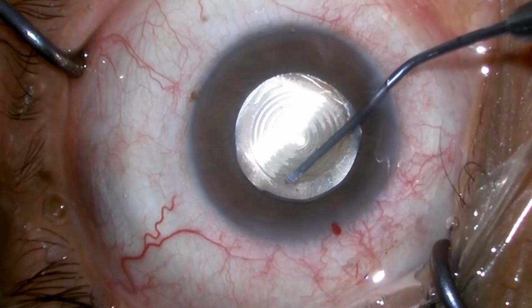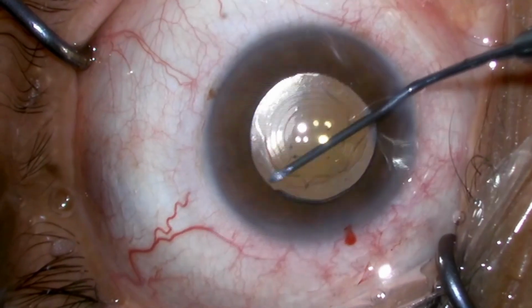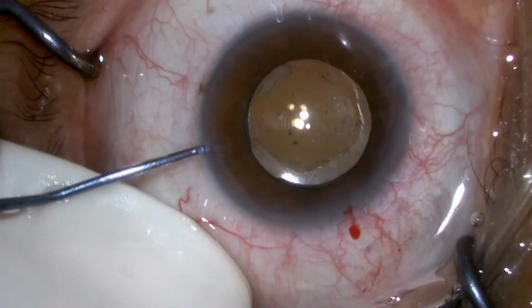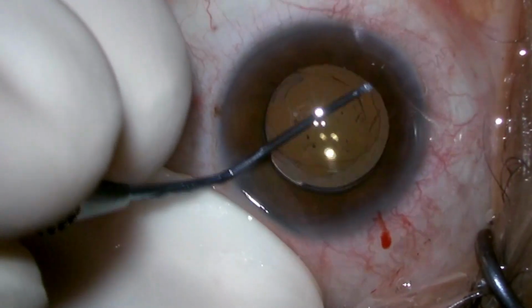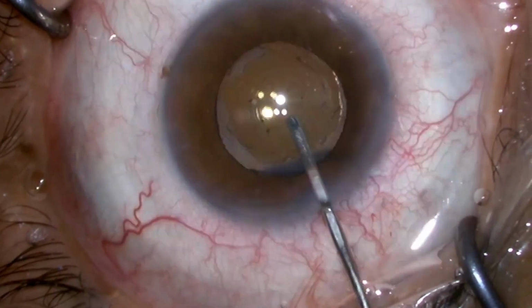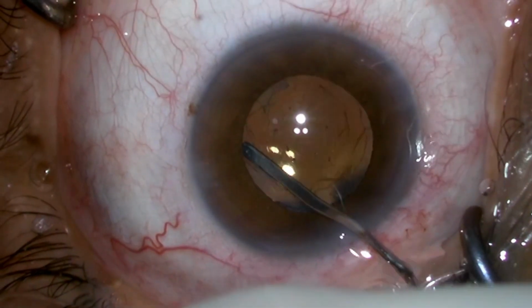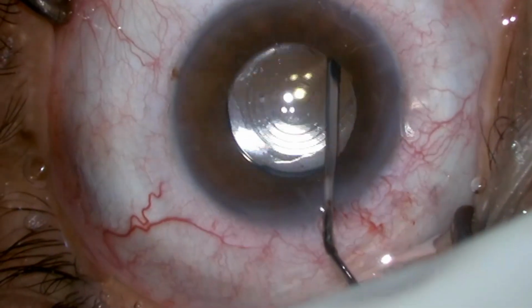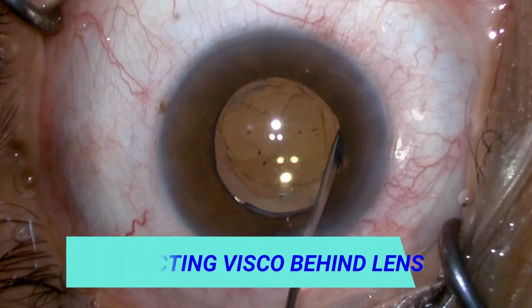Now again with the help of a spatula we are trying to make sure that the anterior capsule is free from the lens. This is done all 360 degrees just to make sure, as the case is 2 years old. Now we are injecting viscoelastic behind the lens, so it will again ensure that the lens is pretty much free from the capsule.